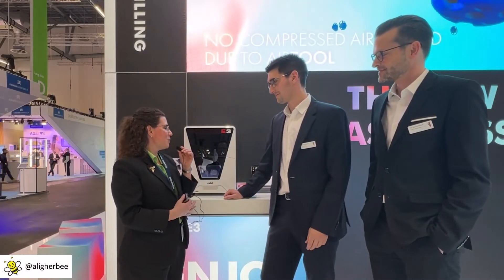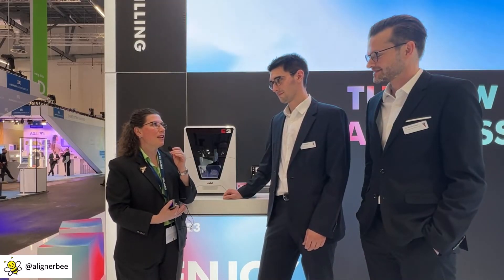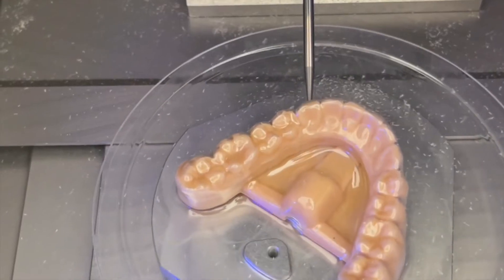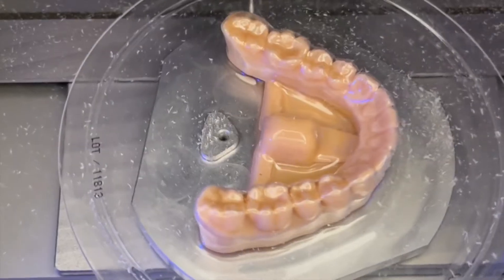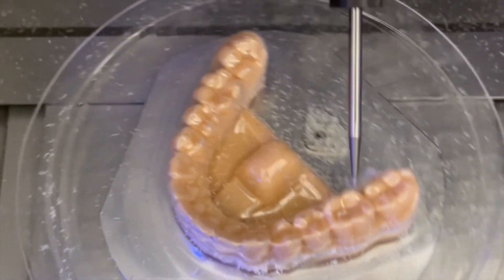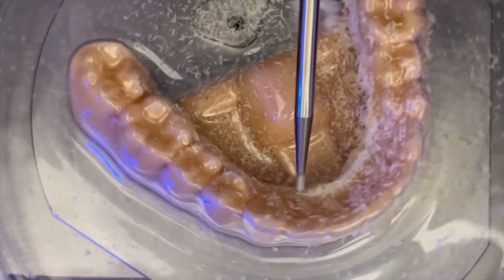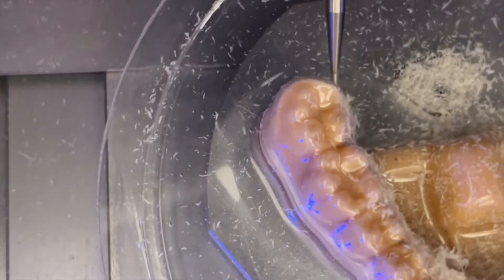Could you explain a little more about the E3 mill? From what I understand, this is a completely independent unit without compressed air and water. Yes — the E3 does not need compressed air and does not need a suction unit. It's just the mill itself, completely independent. We have our own software called TrimCom, which is completely open to all scanners and all CAD softwares. With the software, we can design the trim line, generate the case, and start the mill — a really simple workflow.